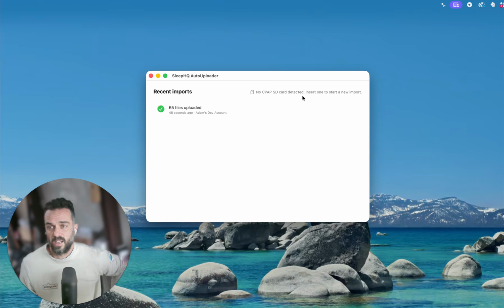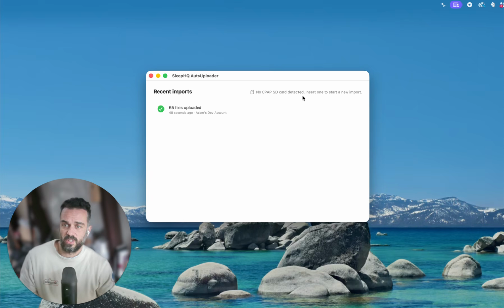So essentially that's it. Yeah, I can't wait for people to give it a go. I think it's really nice. It's a much nicer experience than having to do it through the browser. We've been talking about this idea for ages, and it was really nice to actually sit down and spend some time to build it out.